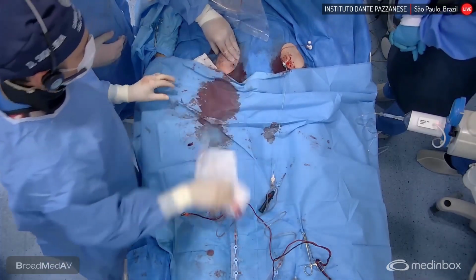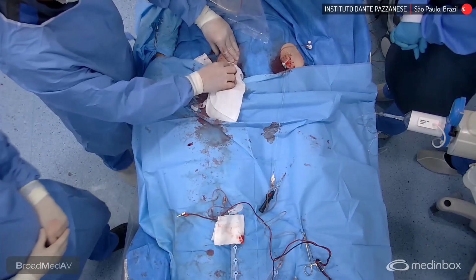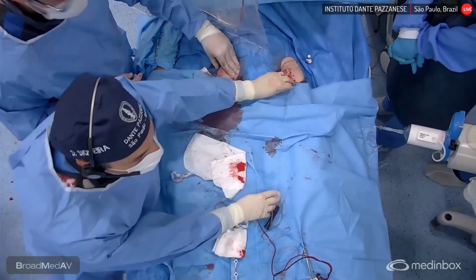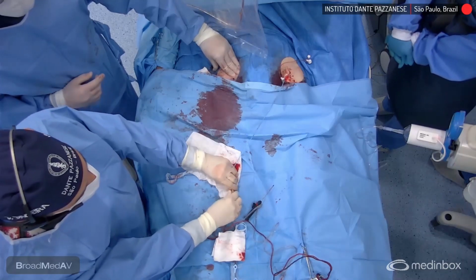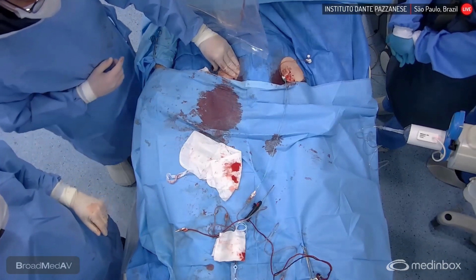Yeah. So, if you remember, we have a 5.2 femoral artery diameter. Is that correct, Dimitri? Yes. You know, Alberto? Yeah, so we are at 5.2, a little bit lower than the minimal. Yeah, we're pushing the limits a little bit. You pushed that, but you did it so carefully.